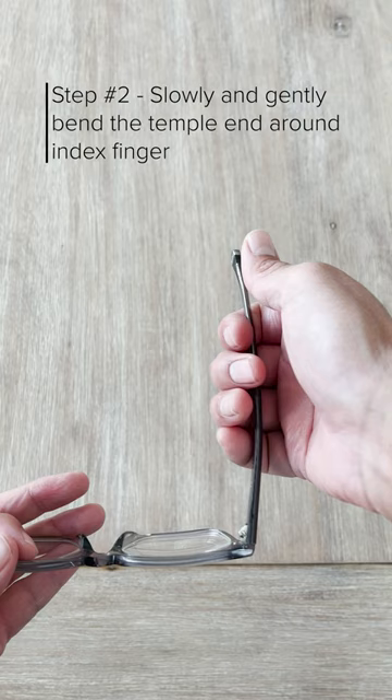Repeat these steps on the other temple and place the eyewear on your head to check fit. Like and follow for more eyewear tips.